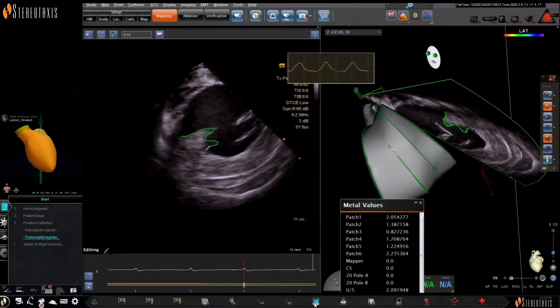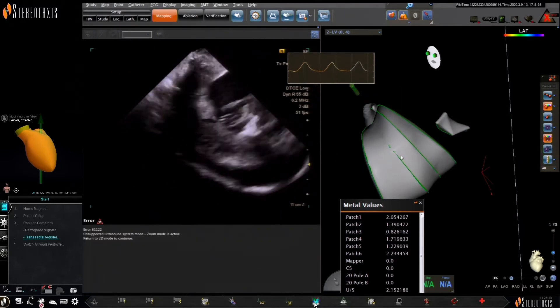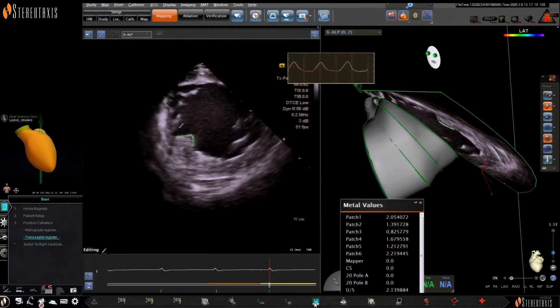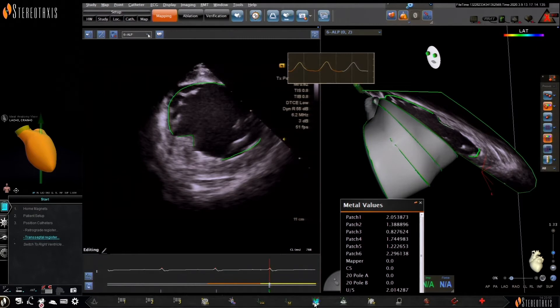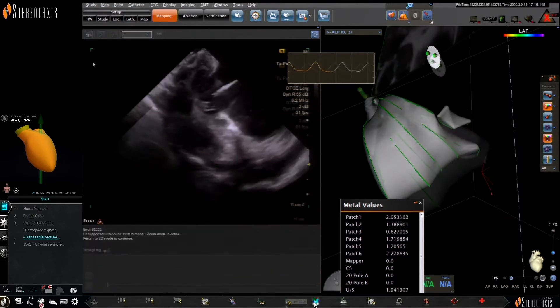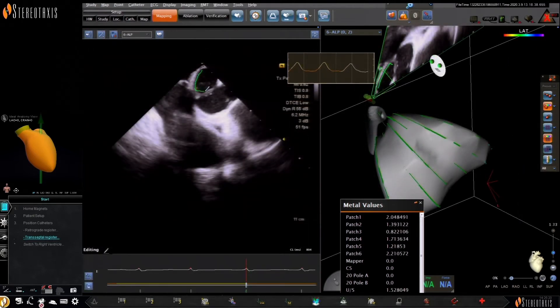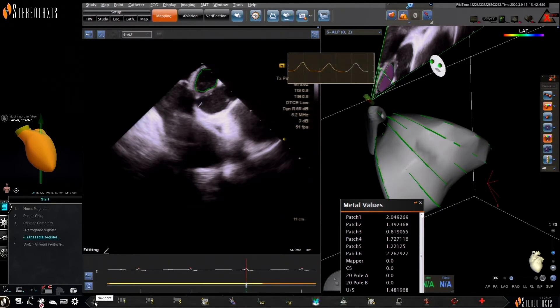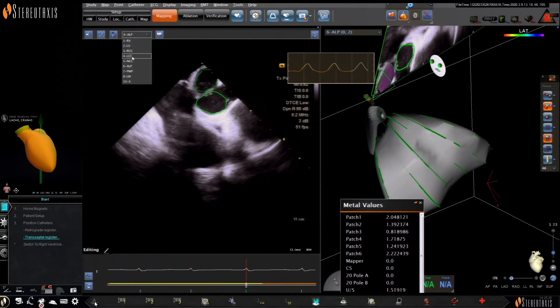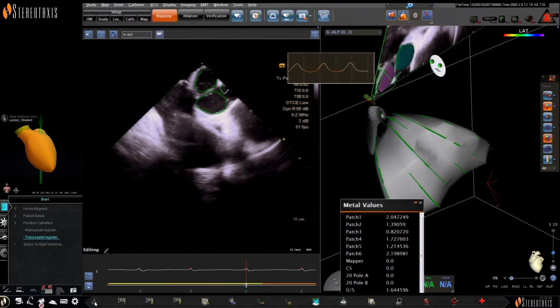The individual contours of the anterolateral and posteromedial papillary muscles were also drawn out, and separating these during your contours can sometimes assist in mapping without the use of fluoroscopy. The aortic cusps were also individually drawn out. Of note, you can see significant calcification across these cusps, which may be concerning in terms of retrograde aortic access, but for all of these RMT-guided cases, transeptal access is preferred.